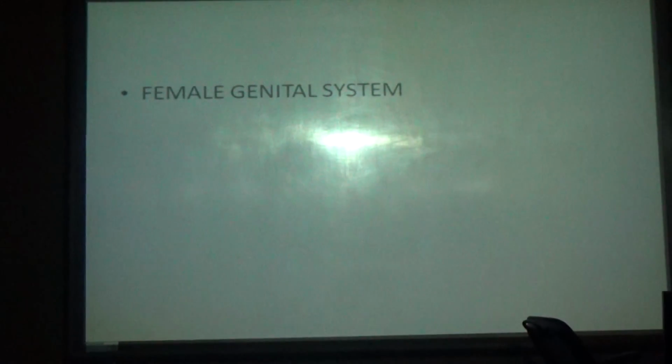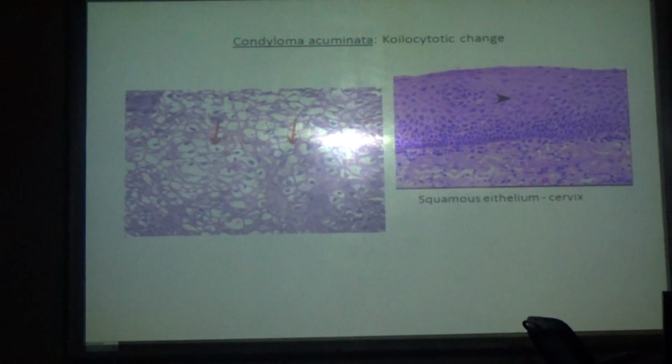Next we will go for the female genital tract. In this female genital tract, this is the squamous epithelium. The lining epithelium of the cervix is squamous epithelium. What are the two parts of the cervix?